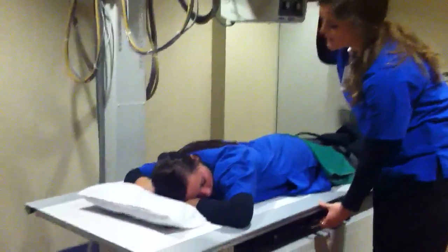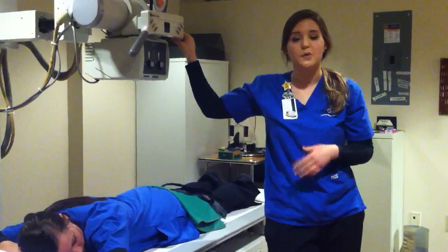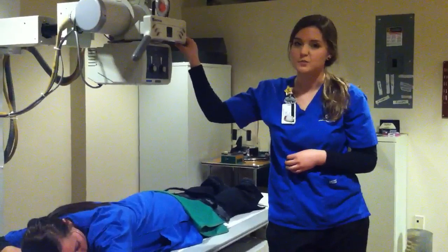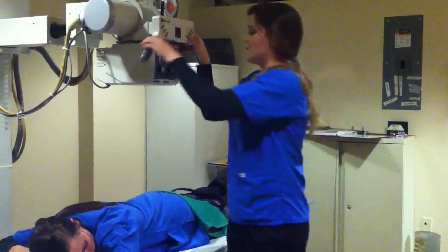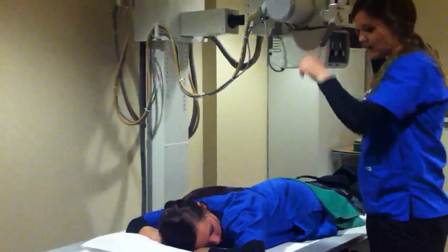So you'll keep doing this every 15 minutes, or depending on the department protocol. It can also vary depending on how fast the barium is moving through the patient. So after that, we'll take the upright abdomen.